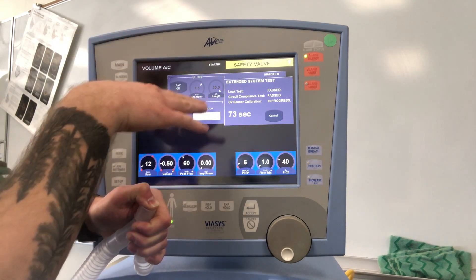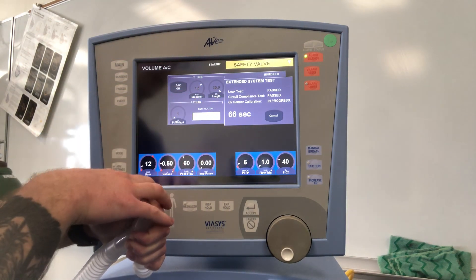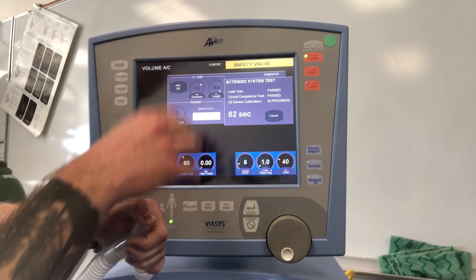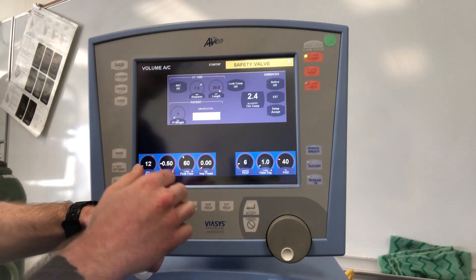The initial leak test and circuit compliance test begin first, taking about 15 seconds — it says we've passed. Later you can go back and view your actual circuit compliance. The O2 sensor calibration will finish within the last of the 90 seconds. Since we don't have oxygen it's going to fail, but keep that in mind.